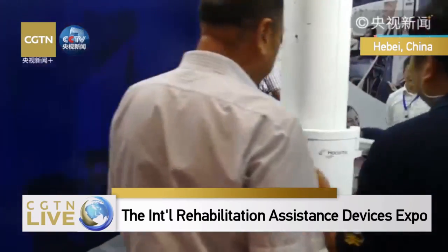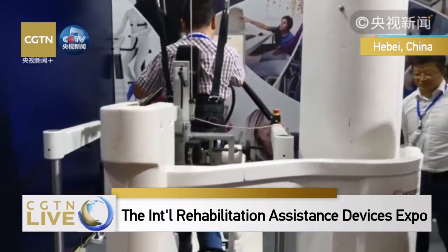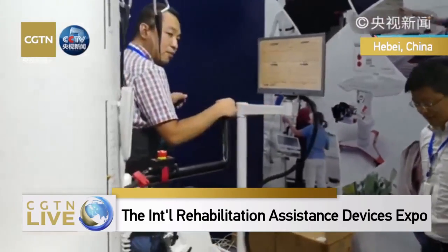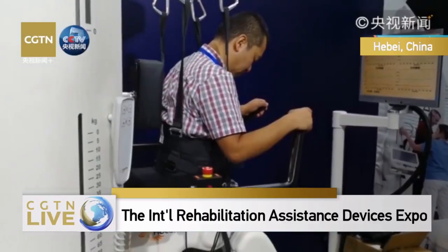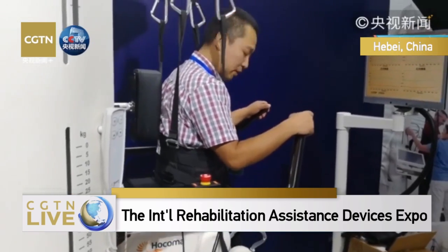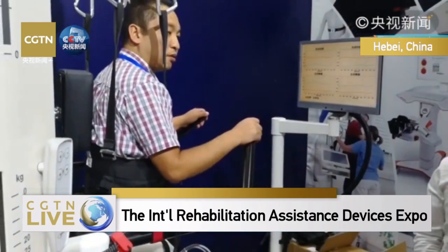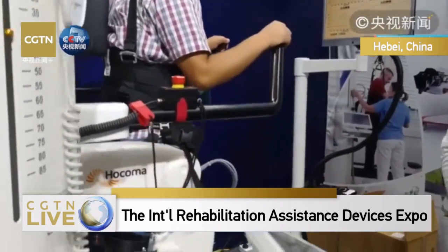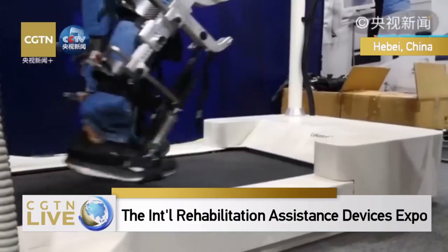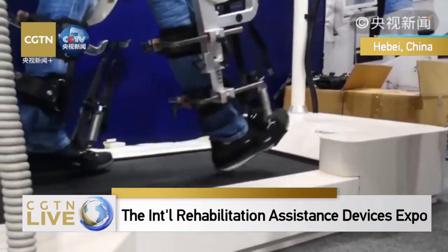This is another walking assistance or rehabilitation facility. It also can be used in a rehabilitation center. When someone is suffering from a stroke, so that the lower limb is not working anymore, you can use this to support the weight and to use other devices to help someone to walk.